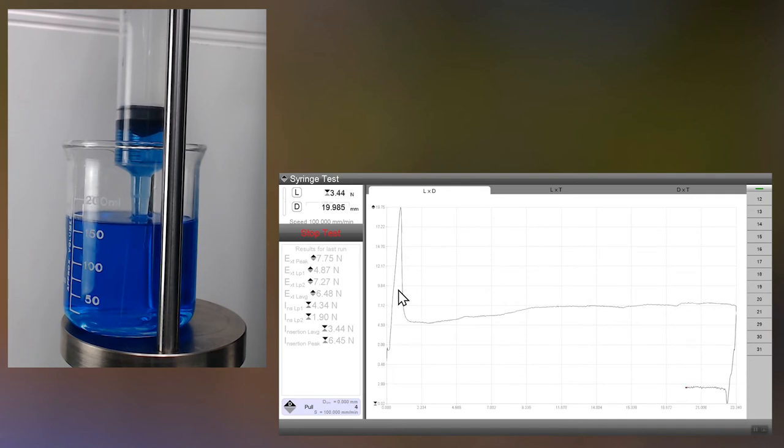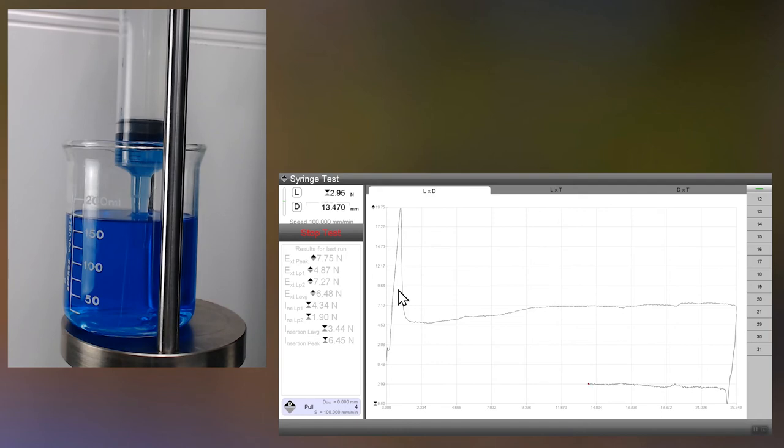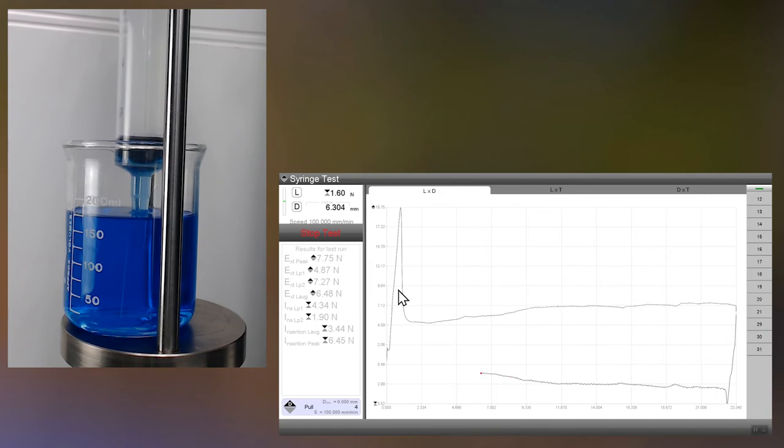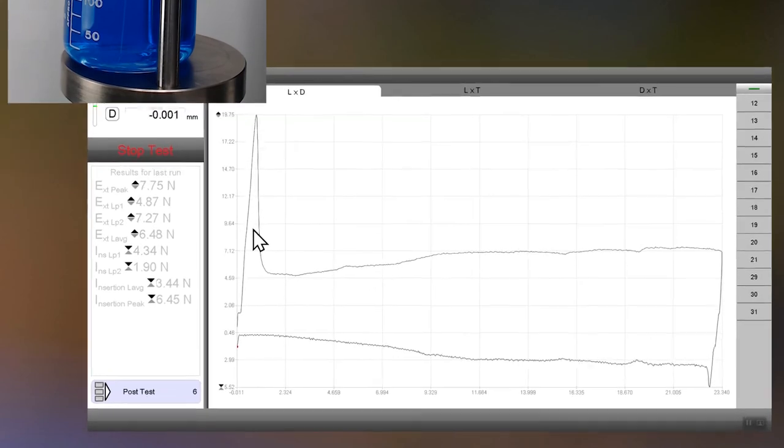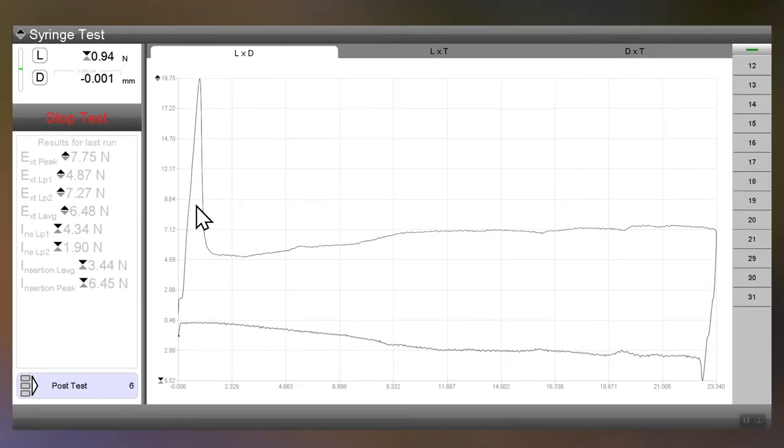And now the bottom half of the graph is basically the insertion. Now we're putting the fluid back into the beaker. So if you notice we've crossed zero so we went from a tension test to a compression test. And there we go the test is done.